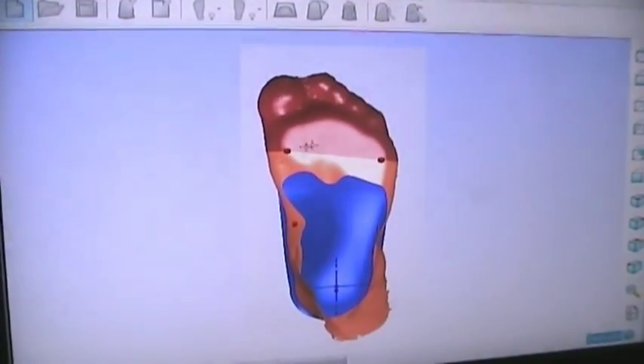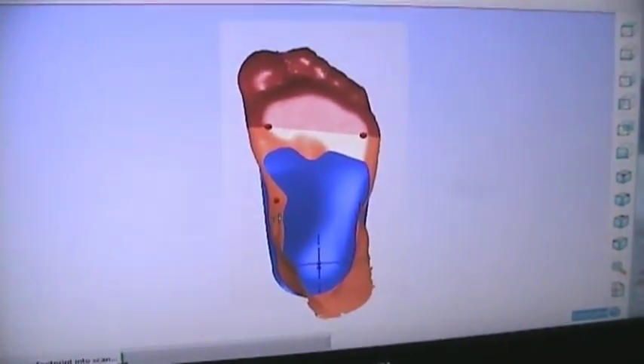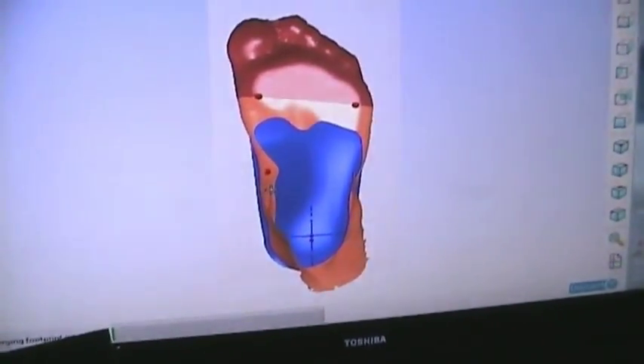Once we change all the options in the software, OrthoModel is going to get the shape of the patient's foot, add it into the orthotic design, and trim the orthotic shape so we can finish the design.